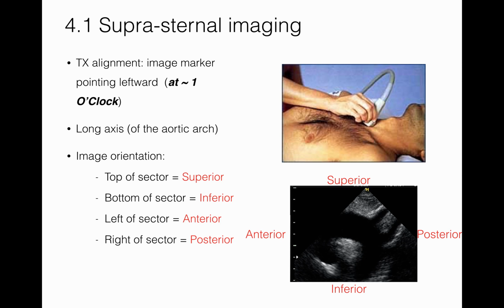With the transducer in place and the image marker pointed leftward at about 1 o'clock, a long-axis view of the aortic arch can be acquired. In this view, superior structures are displayed at the top and inferior at the bottom, anterior on the left and posterior on the right.